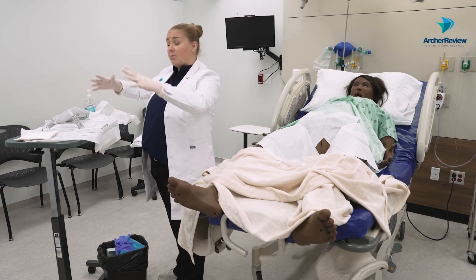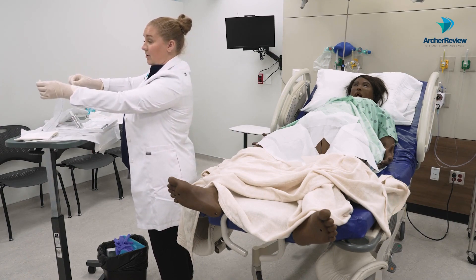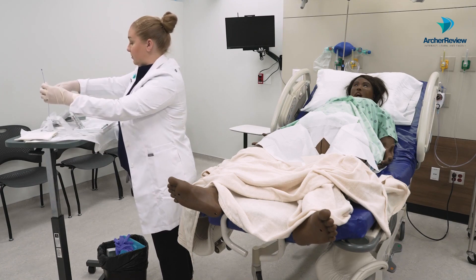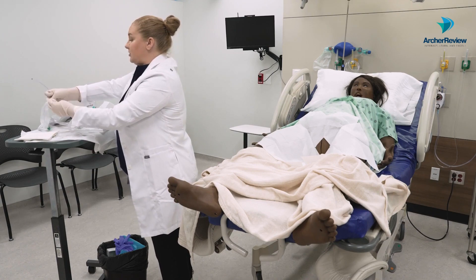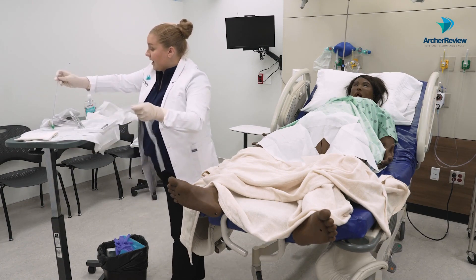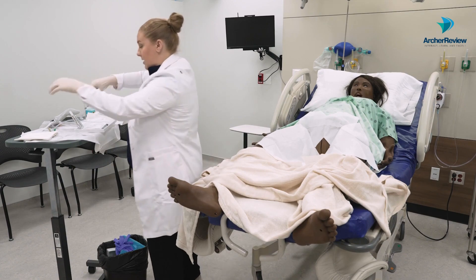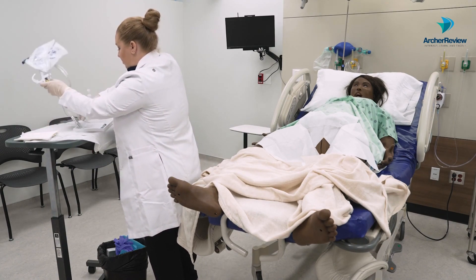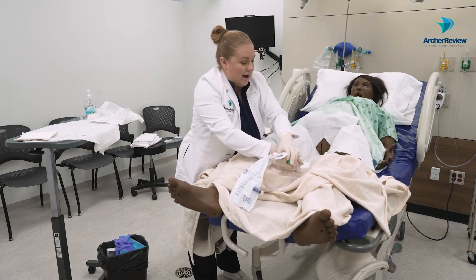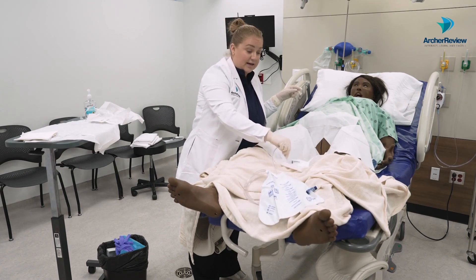Here's where I go ahead and prepare my catheter. It comes in a nice little plastic sleeve and it just rips right down the middle, which exposes the tube — this is what's going to go into your client's urethra and up into the bladder. Once I get all that plastic off, I place the tip of the catheter into the lubricating jelly already in my tray. I'll drop the packaging in my discard pile, then take my prepared tray over to the sterile area I prepped — that's why getting all the draping done was so important. The drainage bag sits right here at the ready, catheter sitting in the lubrication.